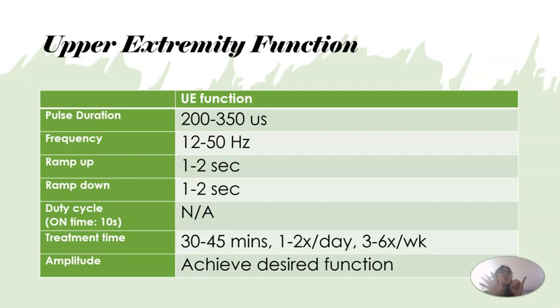No? Bakit naging 6 seconds? Kasi you have to include the ramp up and down. So, if you have 2 seconds for ramp up plus 2 seconds for ramp down, plus yung 2 seconds na tinansya mo kanina na needed for the release. Okay? So, pag-add mo yung tatlong yon, it would equate to 6 seconds. Remember, kasi yung ramp up na yan, gradual yung pagpasok ng kuryente. For ramp down, gradual na pag-exit ng kuryente. So, i-account nyo rin yun sa on time sa duty cycle.